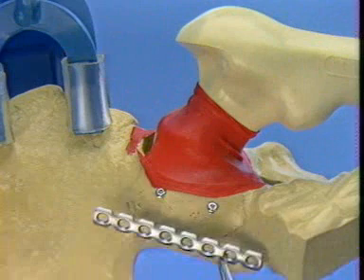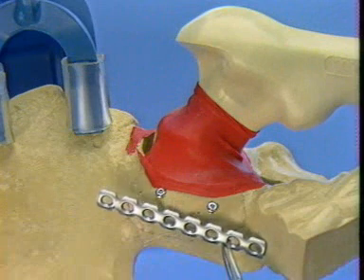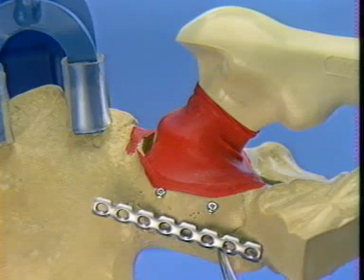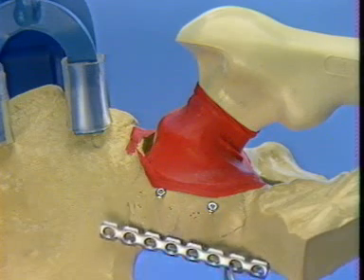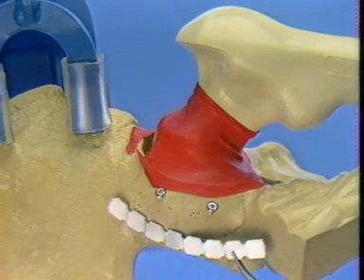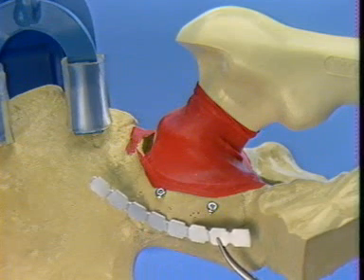Fixation is completed by application of an 8-hole straight 3.5 reconstruction plate, which spans the posterior wall fracture from the inferior ilium to the ischial tuberosity. A straight plate is used because it's more flexible than the curved plate. However, it's contoured into a curve that parallels the posterior rim of the acetabulum. A curved 3.5 reconstruction bending template is often helpful in contouring the plate.